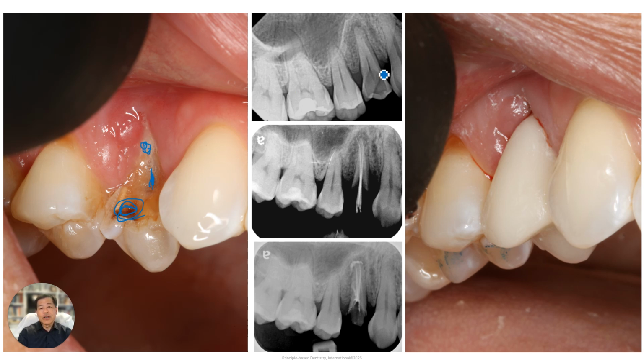So we went ahead and we did our root canal procedure using a reciprocal system, a One Reci system. And we gained our access. Now, why One Reci? Because it's a minimally invasive type of shaping that we can do. So in this case where I don't have a lot of tooth, I wanted to conserve the tooth structure that I had. Here is our gutta percha try-in, to make sure that we were lengthened, that I had the two canals. And then here is our obturation and fill. And you can see that because of the infection of the apical area, there was a little bit of overfill, but I used the bioactive sealer, so I'm not even worried about it.